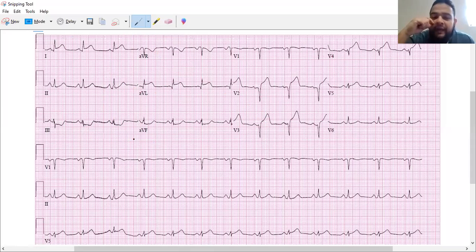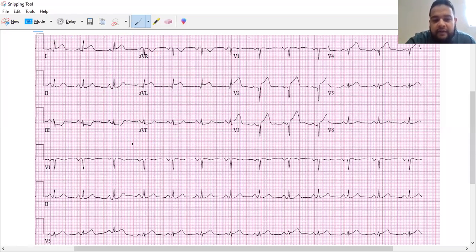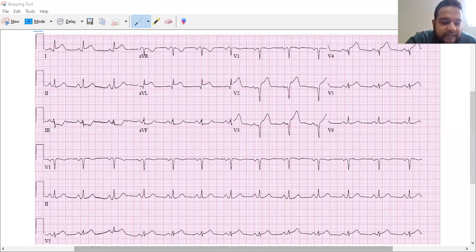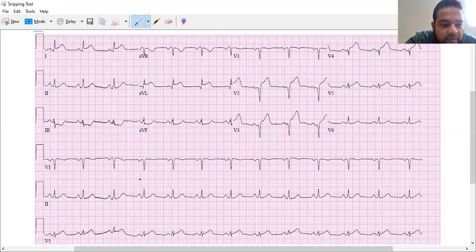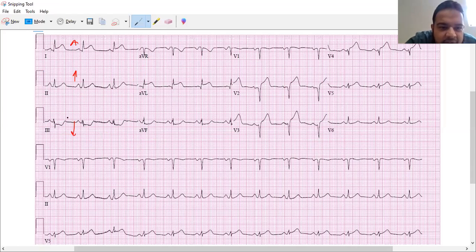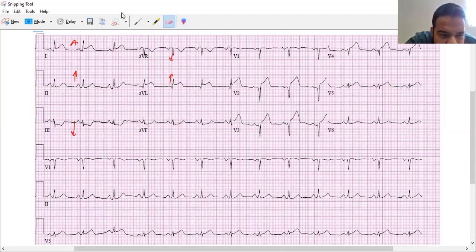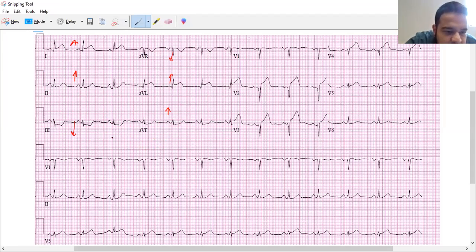So as we discussed in the previous video, the first step for the isoelectric method is to see which lead has equal positive and negative deflection. So lead one is mostly positive, lead two is mostly positive, lead three is mostly negative. AVR is mostly negative, AVL is mostly positive, and AVF is mostly positive as well. So I think I'm going to go with three as my isoelectric lead.